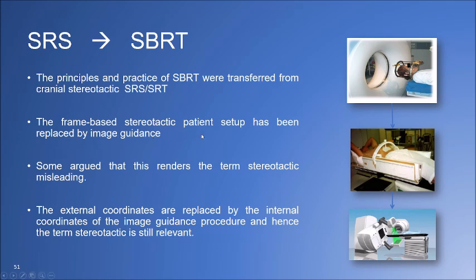The frame-based stereotactic positioning of the patient has been replaced by image guidance here. You cannot fix the patient in a frame; frames for the body also came up long back, but that was not a possible solution. So they went in for image guidance for patient positioning. Some of them argued this renders the term stereotactic misleading, but in my opinion, it is still stereotactic because the only difference is the external XYZ coordinates are now internal XYZ coordinates, either with X-ray imaging, or with cone beam CT, or with a surface imaging system, right?